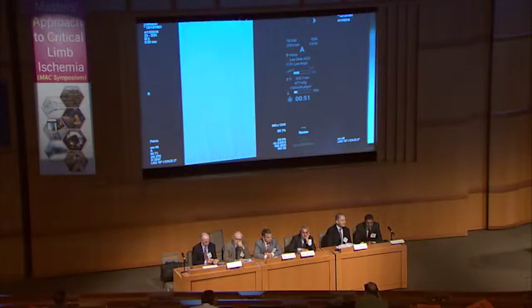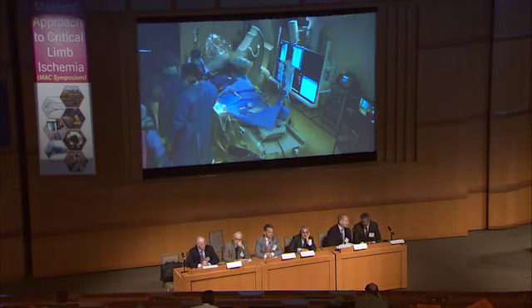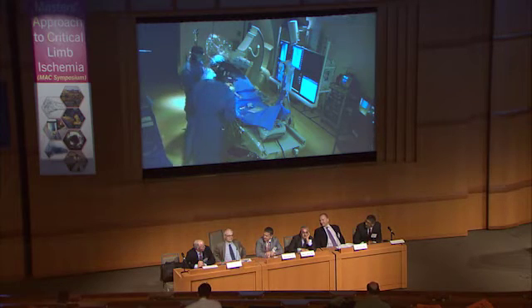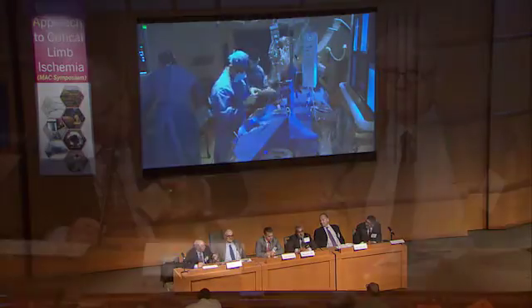See, this is just showing you that you had profunda contribution from the start. What you're just assessing is what is the SFA contribution to it. That's what we're after. But just to complicate things further, Bruce, whenever we dilate the SFA and we create dissections, you open up little communications between the artery and the vein. You'll see little mini AV fistulas after you dissect an SFA. So that's going to further complicate the assessment here. I think either way, it's going to look like there's an AV fistula between the SFA and the vein.